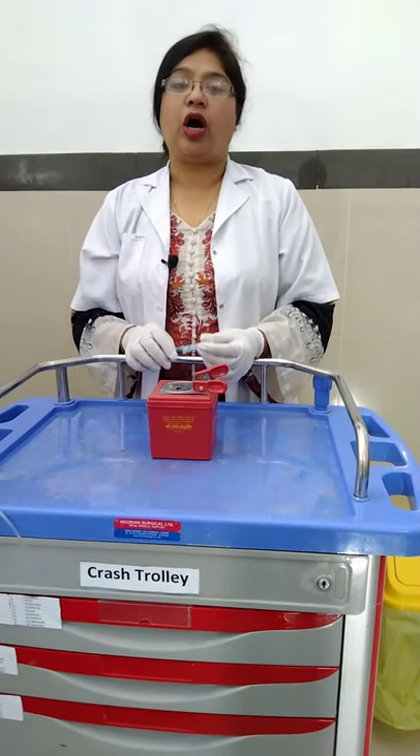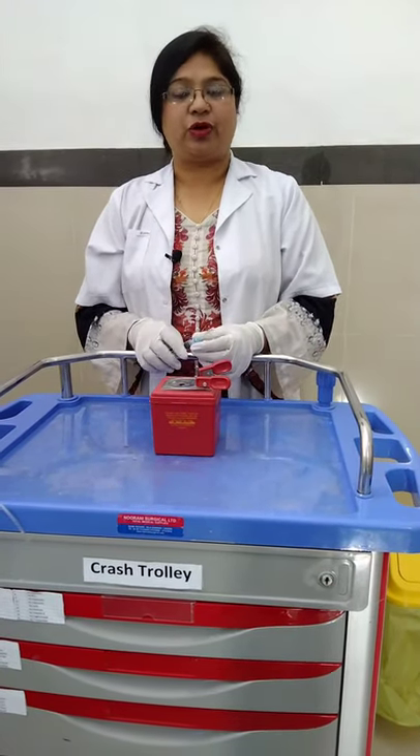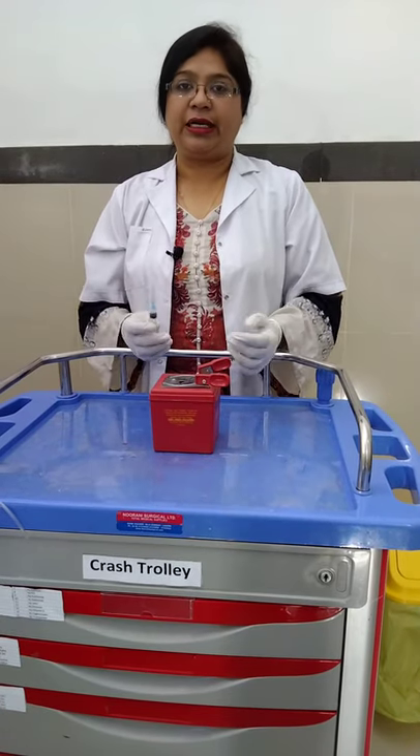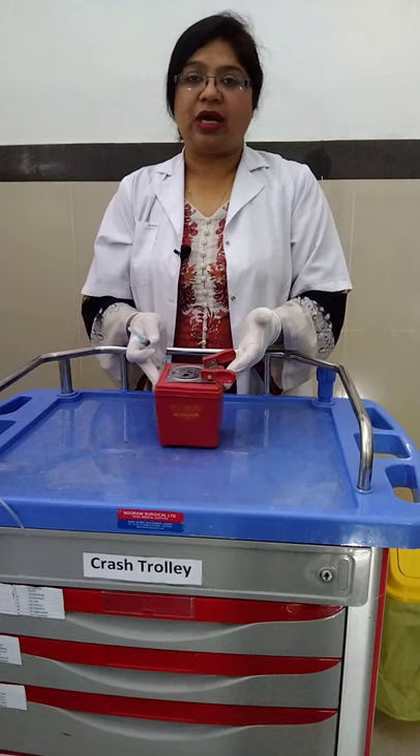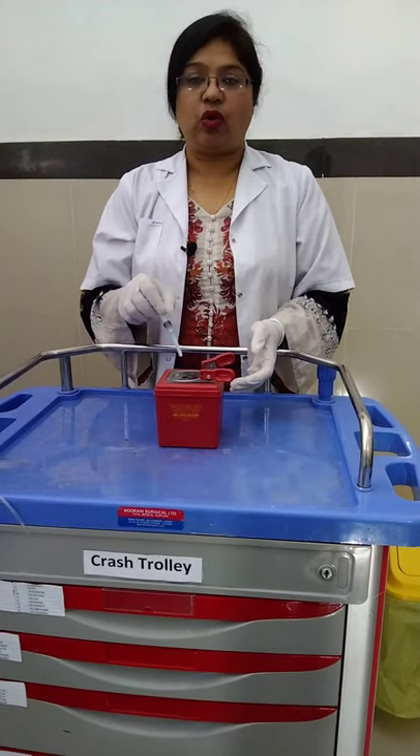Hello viewers, today I will tell you how to discard or dispose of used syringes or needles through a manual syringe cutter. This is a manual syringe cutter which has two orifices.